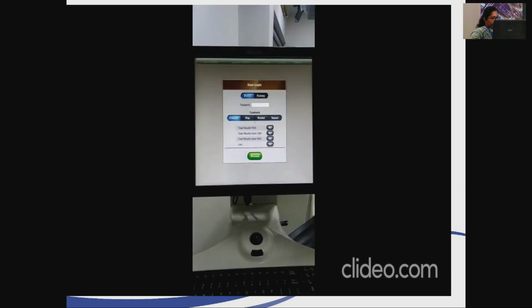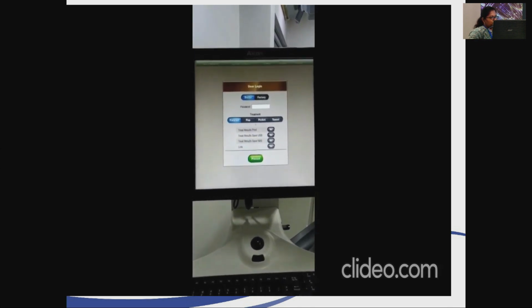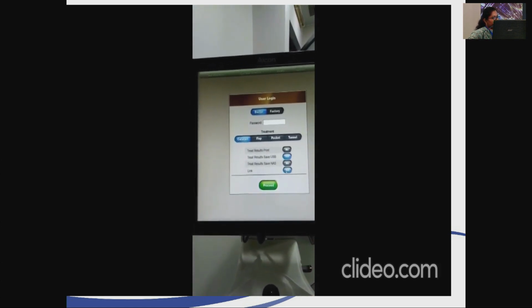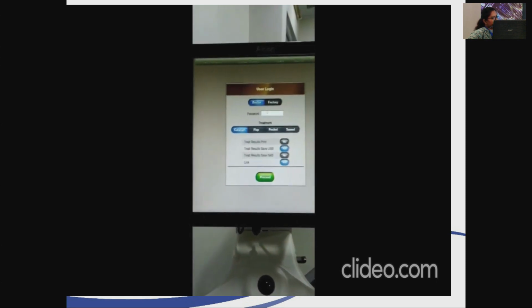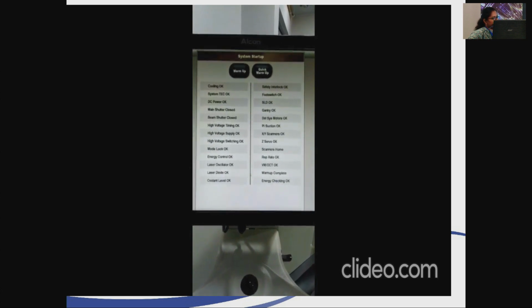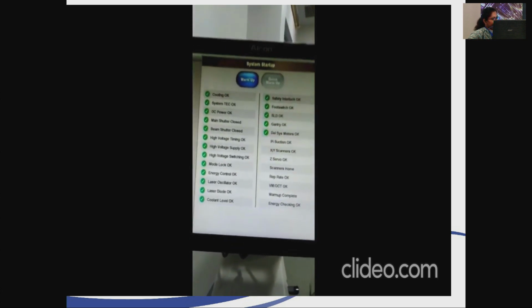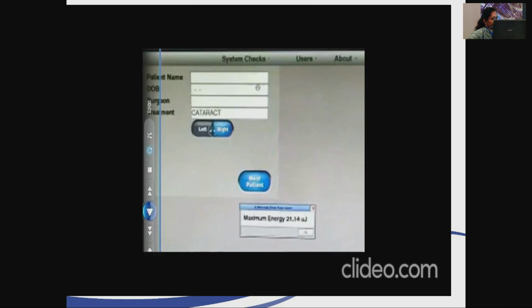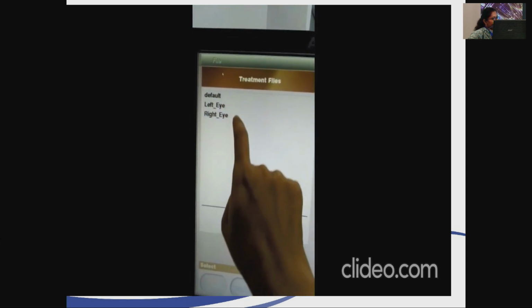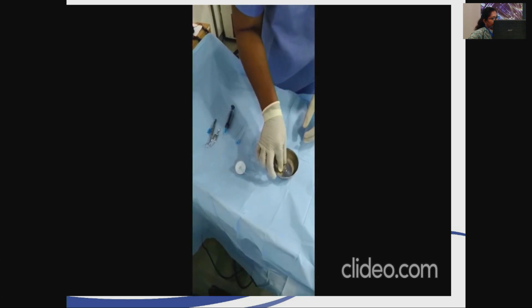This is a small video which shows primarily how it is done. So this is the opening of the procedure. We are just opening our machine. We upload the patient details, and we have a warm-up time of about 10 minutes. There is a Verion attachment to the LenSx. The Verion is uploaded into the LenSx, and then we again upload the patient details, because the Verion should be attached to the LenSx and uploaded, so we can reciprocate it into the theater.